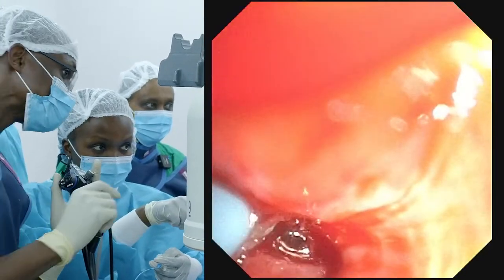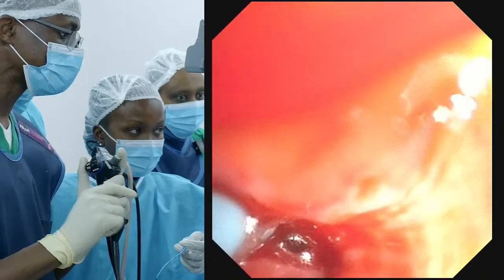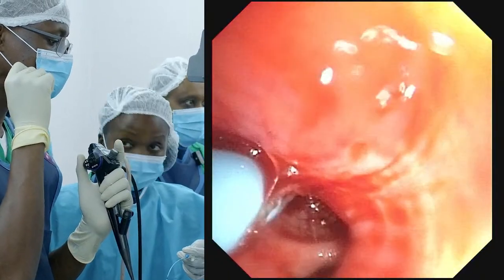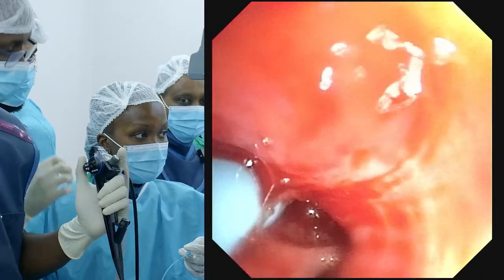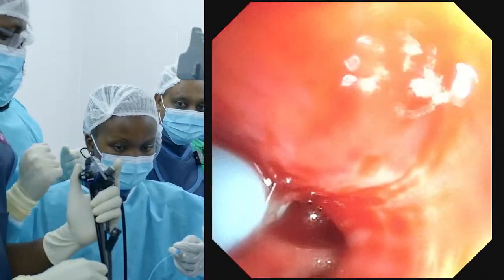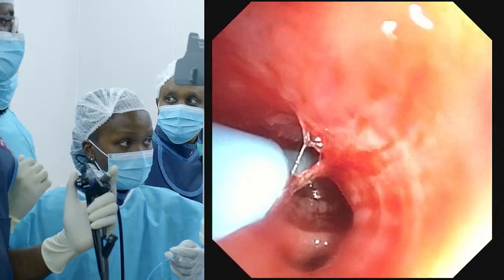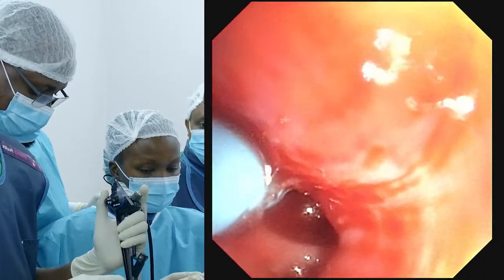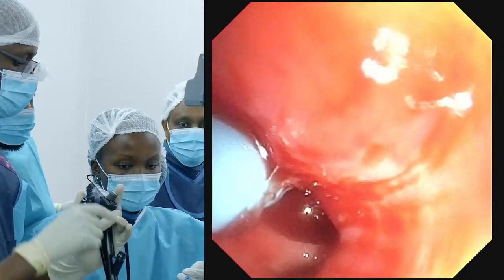Yeah. You take the probe. The probe. And just count. So the motion is going to be very nice. Just yank it like a very quick jerk. And once you see it coming out, you press the balloon. And just make sure it doesn't bleed.